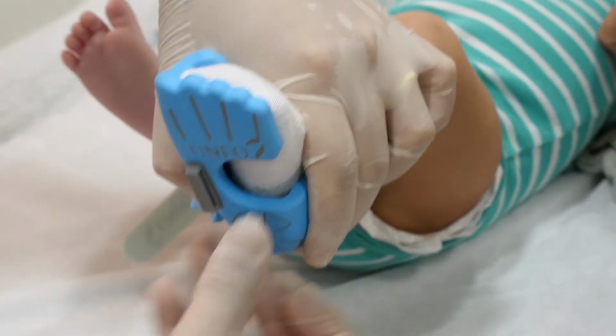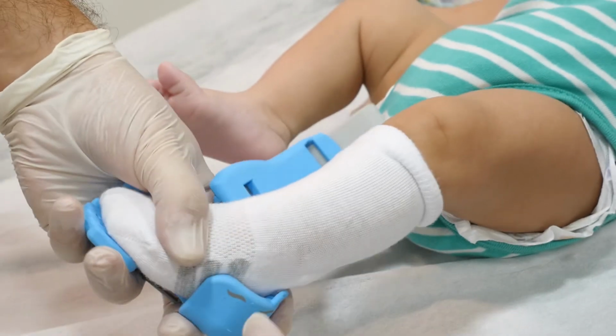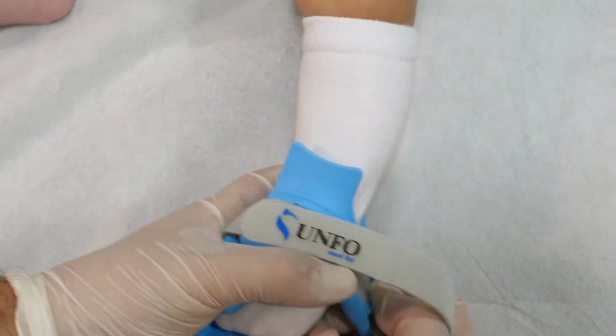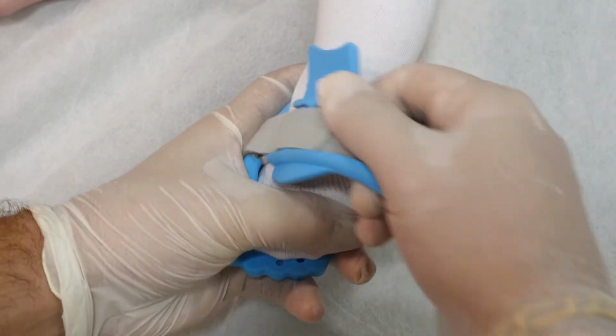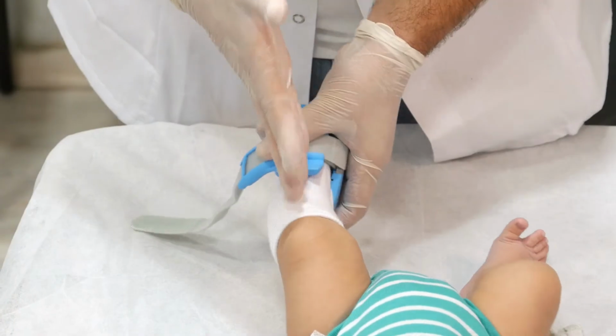Make sure that the heel and the end of the brace have a tight contact in that the whole foot tightly touches the bottom of the brace. After inserting the foot into the brace, adjust the cushion so it's in the center of the foot, aligned with the middle of the shin.